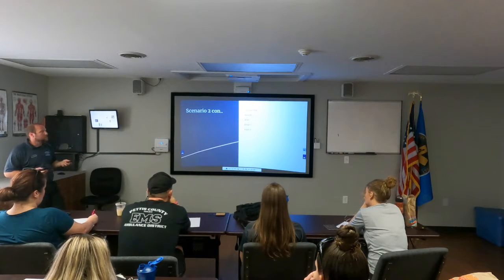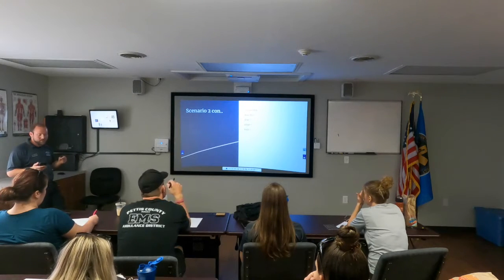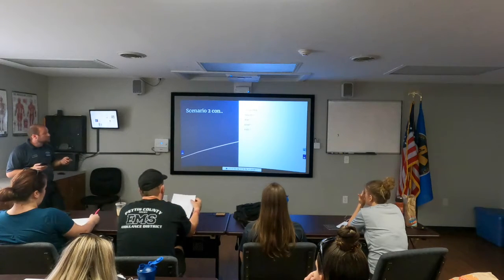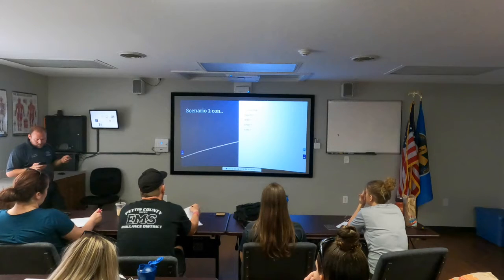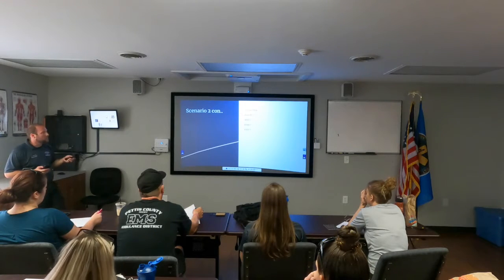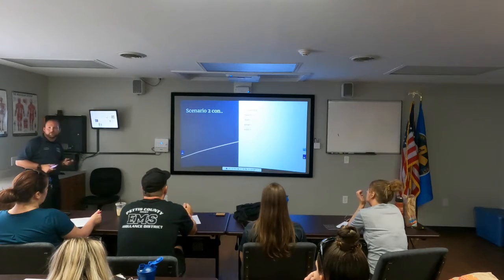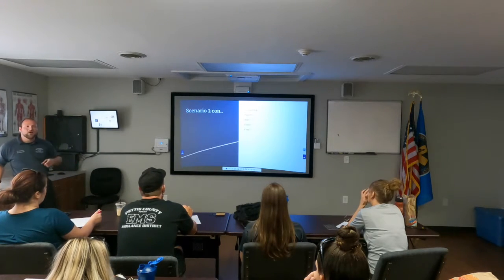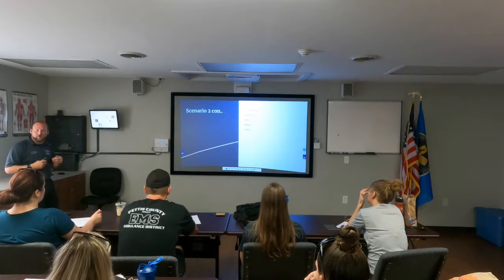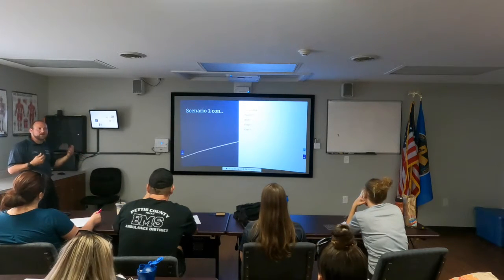The IPAP, to achieve that, because we're not increasing our P. I'm sorry, we are. We're going to do the 12 for our IPAP. EPAP should be 4, and our new FiO2 between 0.5 and 0.55. That's where we should be, as far as moving our ventilator or BiPAP settings, due to their current recent ABGs.